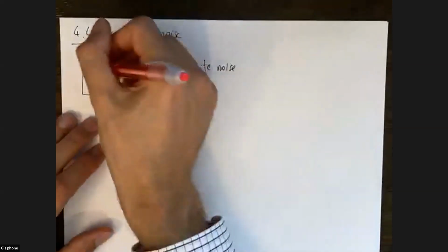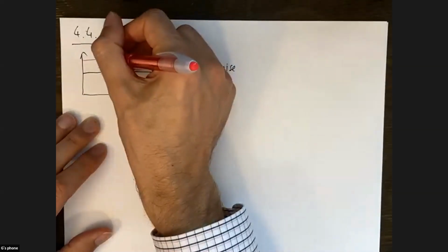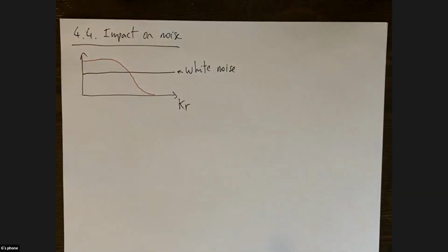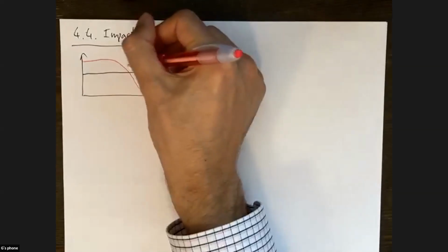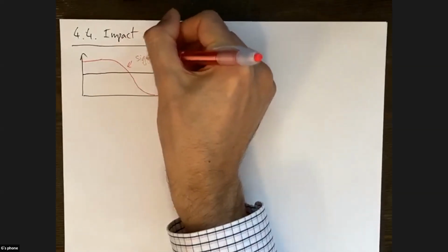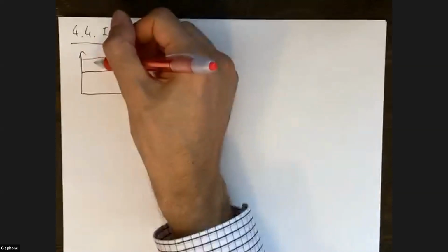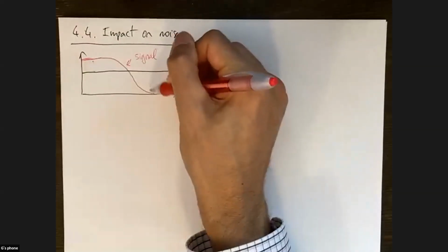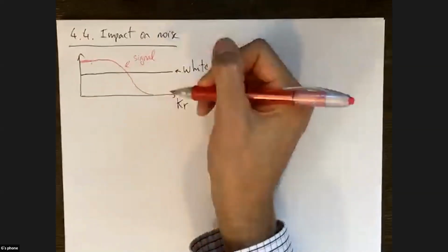But the signal is going to contain a certain amount of low frequency signal, but because of the limited spatial resolution of the camera, there's not going to be any useful high frequency information in the signal, right? So this would be the signal here. Okay, and so if you talk about signal to noise ratio, we can see that in terms of low frequency, we have an abundant signal compared to the noise, but in the high frequency, the information of the image is dominated by the noise. So there's more noise than useful signal.